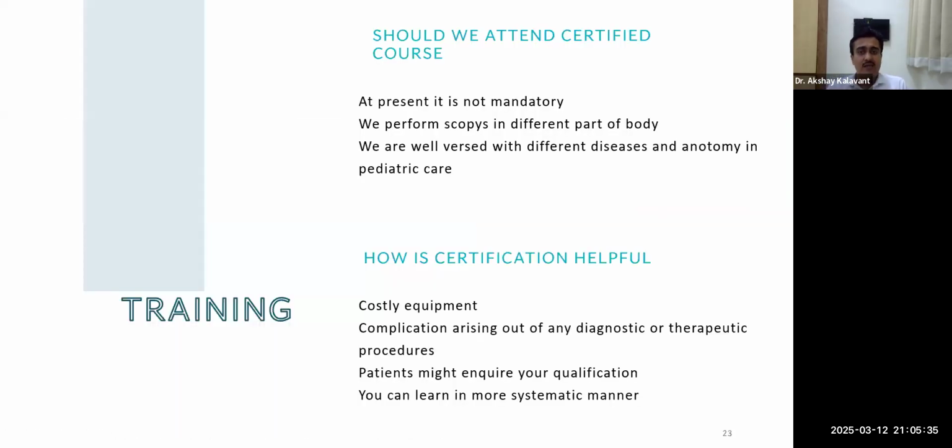Now, the next question is training. The question some of the people would ask is, should we attend certified courses? At present, it is not mandatory. It's not that if you have to do endoscopy, you need to be certified. We perform many scopies as pediatric surgeons. We do endoscopy, bronchoscopy, rigid esophagoscopy, cystoscopy, thoracoscopy, laparoscopy. So it's not difficult for us to get hands-on with this and perform this scopy. And we know the disease as well. So it should not be difficult for us without a certified course. We are well versed with the different diseases and with the different anatomy of a child. So I think we can still get away without getting a certified course.